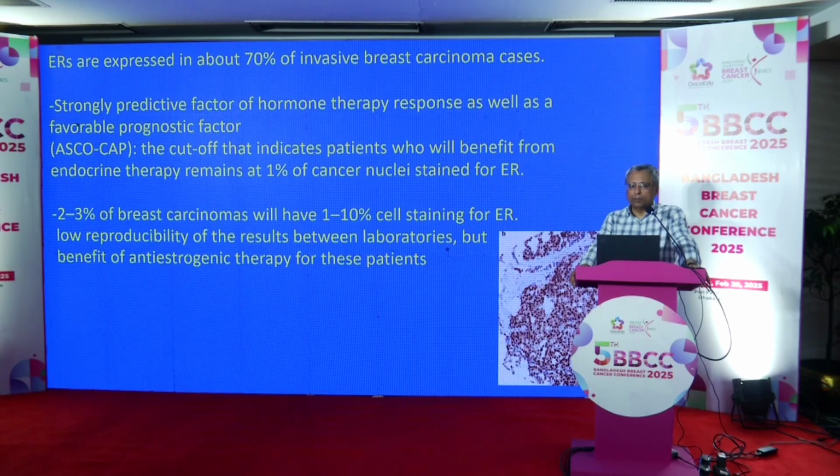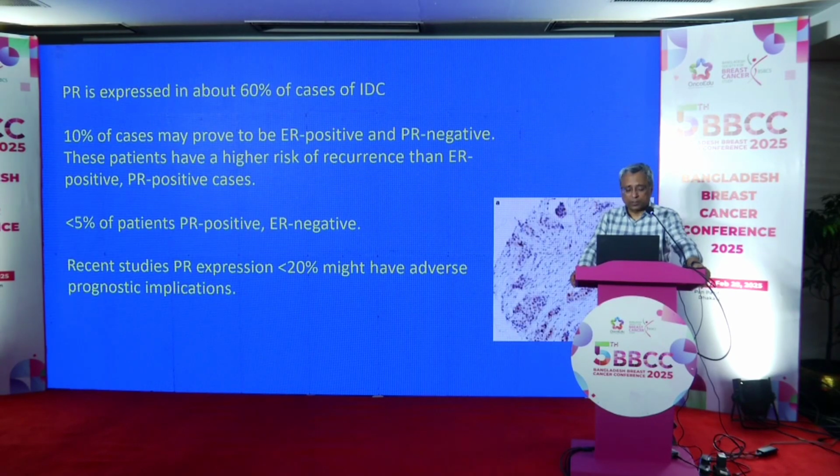So a little bit about these biomarker assays. First, if you look at ER, it's the most common positive biomarker, and it's very strongly predictive for hormone therapy response as well as a favorable prognostic factor. So far the ASCO CAP guideline says that even as little as 1% staining indicates benefit for patients. Of course, there's the low ER staining, which ranges from 1 to 10%. And even with this low expression, they will benefit from anti-estrogenic therapy.